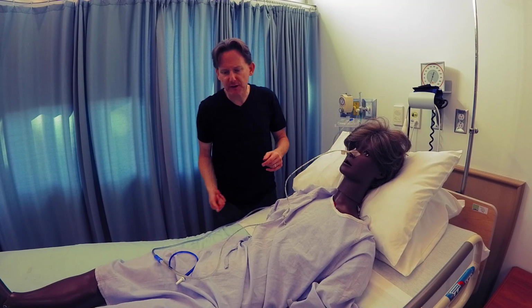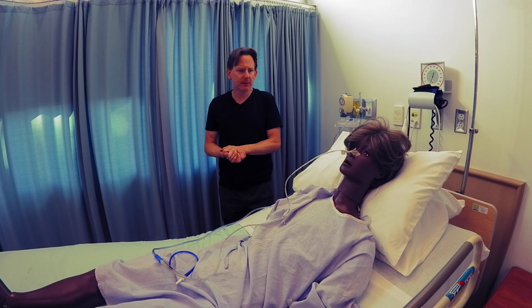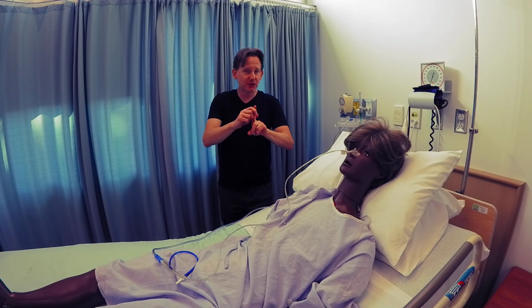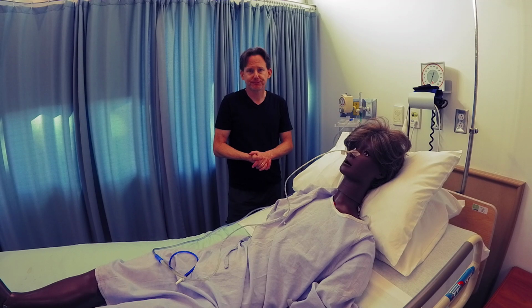Of course, if none of that works, you may need to collaborate and have the NG tube reinserted, the new NG reinserted. Those are just a few ways of troubleshooting through the NG system. Again, the main thing that's going to tip you off that the NG tube is not working right is either, one, your patient's complaining of nausea, or two, you look at the system and things aren't flowing at all. It could be one or both of those things. And that concludes our brief video on troubleshooting some common complications with NG tubes.